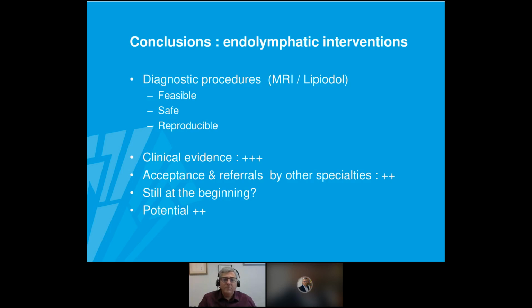The first one is, do you have any tips for puncturing the thoracic duct? How do you prevent the duct from collapsing? Well, you have to puncture the thoracic duct where it is the largest. Of course, we try to avoid puncturing directly into the thorax. What we like to do is try to puncture the cisterna chyli, which is in the upper abdomen, which is also larger than the thoracic duct and easier to puncture.